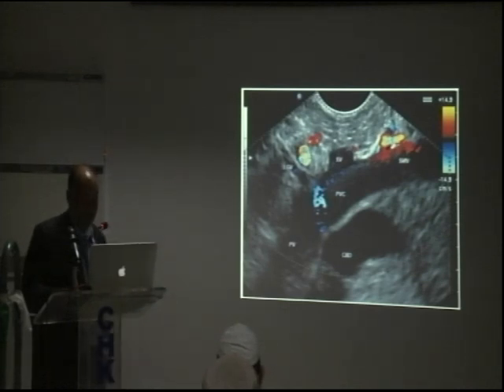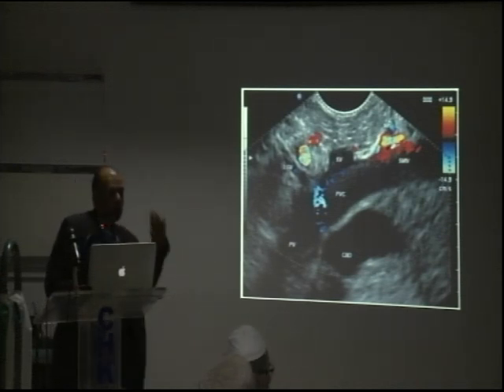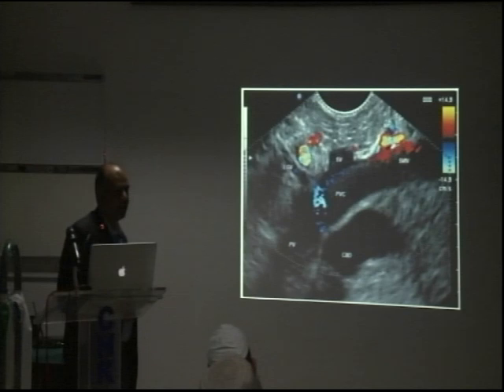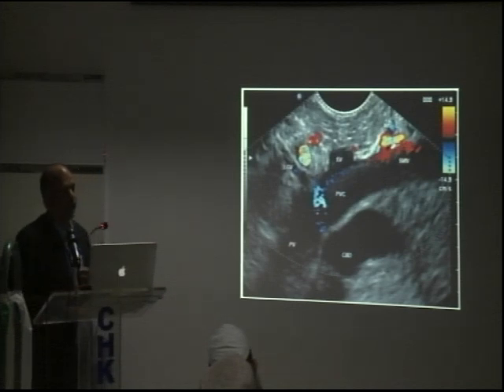The other thing is that it's easy to pick it. If it was the duodenum, the bile duct should be closer to the transducer. So remember the point: if the bile duct is farther away from the transducer as compared to the portal vein, that means you're not in the duodenum. That's an image from the stomach. So that flips when you're in the duodenum.